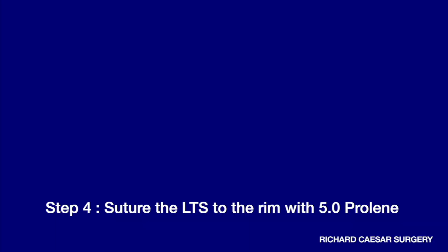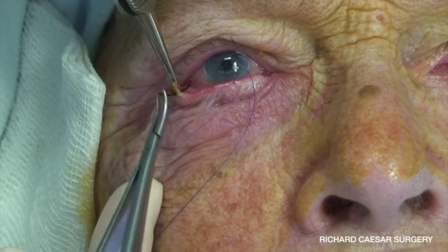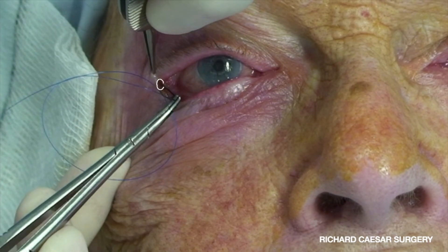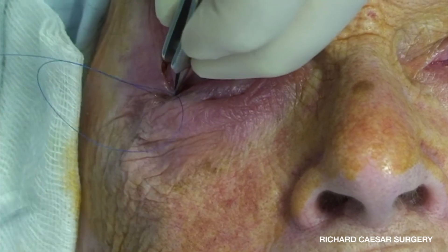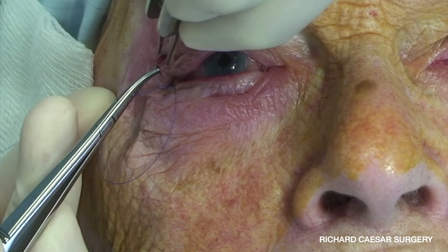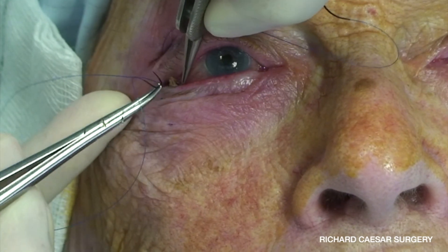The tarsal strip now needs to be sutured to the rim with 5-0 double-armed prolene. I pick up the tarsus from the interior to the exterior rather than exterior to interior, as I feel this helps tuck it to the inside of the rim. At this point it's absolutely vital that you have fully opened up the tunnel between your incision at the lateral aspect of the lid crease, because you want the tarsal strip to drop into it completely freely. If you pull the tarsal strip up against tissue, it will simply spring back out again.